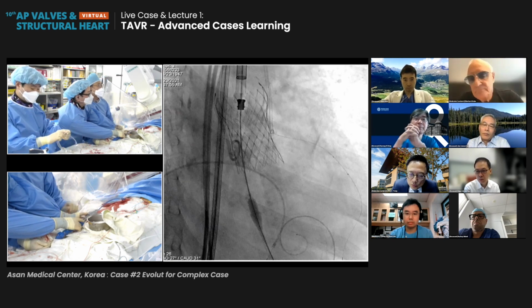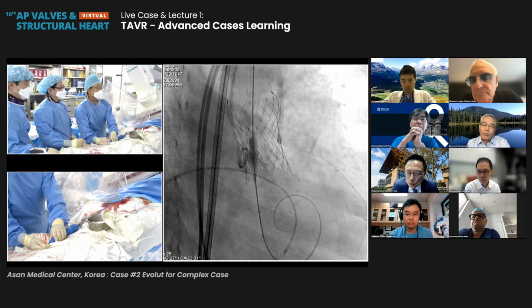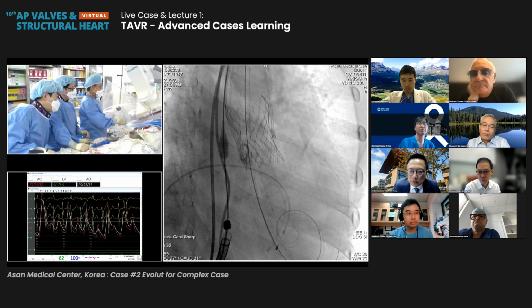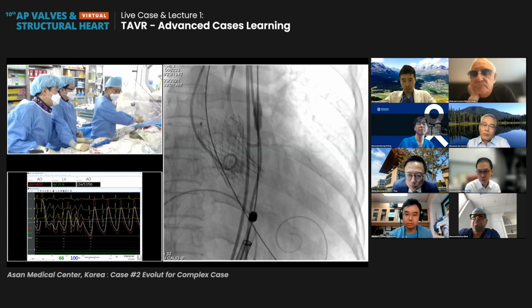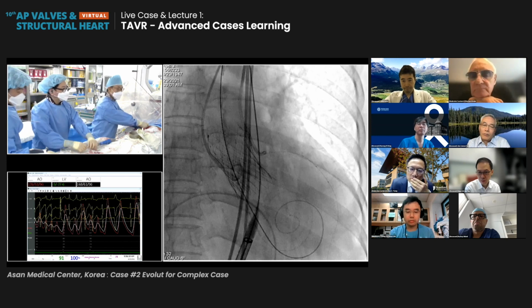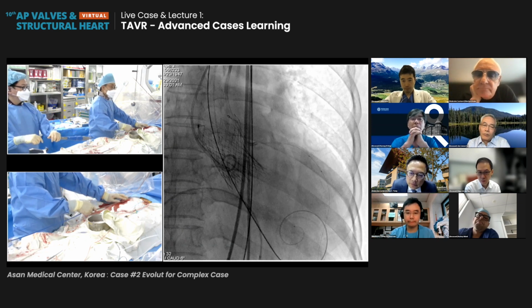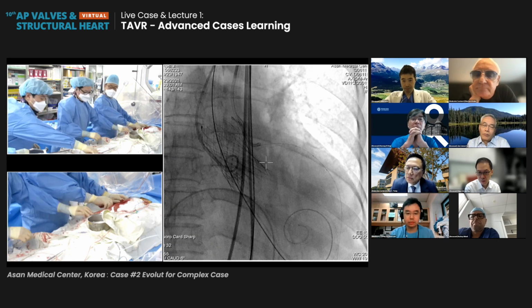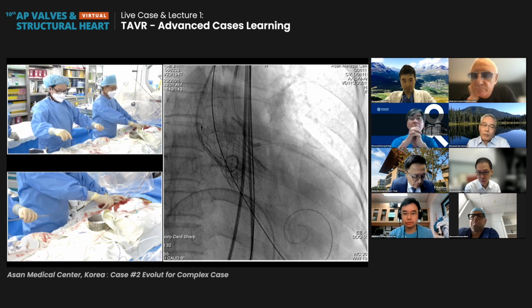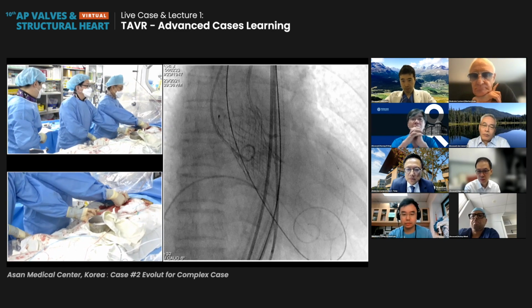Okay, and then we're gonna measure the simultaneous flow hemodynamics, and at this moment, it's very careful to pull back the valve. Okay, got it. Here. 자, 주문 풀고 여기 내려와서 이거 다시 한번 붙이고, and then we simultaneously check it up. The AP로 놔두고, status. 자, 요거 이제 붙이고. 예, 알겠습니다. 그러고 나서 바로 빼고. 시스 준비했어요. 시스. 준비됐죠? 네. 자, 뺀다. 자, okay. And then the measurement and the simultaneously. Okay, got it. Sheath. And then we're gonna measure the simultaneous pressure monitoring, how much significant. Okay, 이제 들어갑니다. 밑에 돌리고, yes, okay, got it. 볼게요.